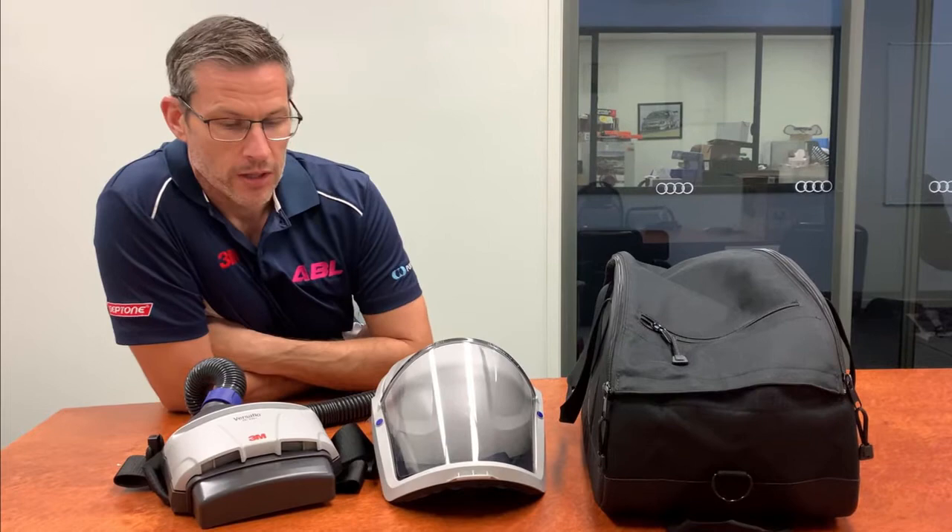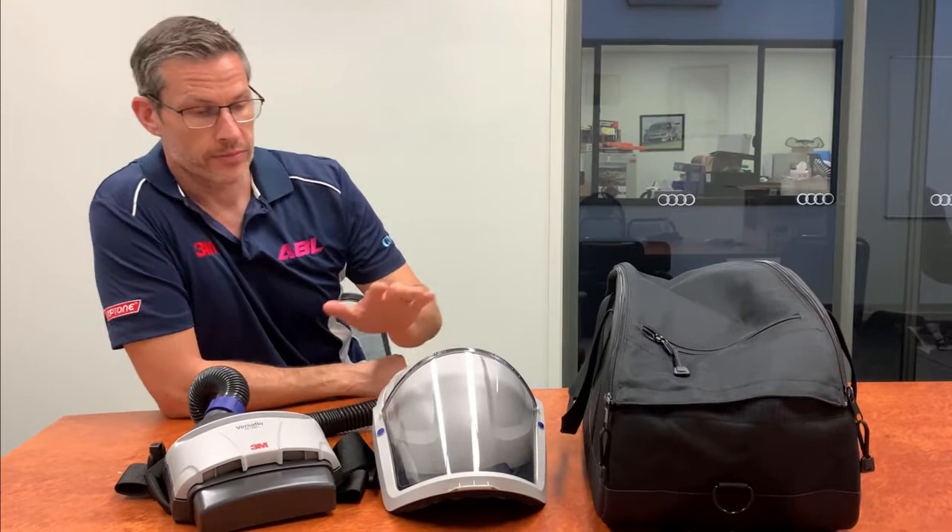Today we're going to show you how to assemble the 3M TR-300 Powered Air Respiratory System. What you have here is the power unit and battery, your air hose, your helmet, and a handy carry bag.